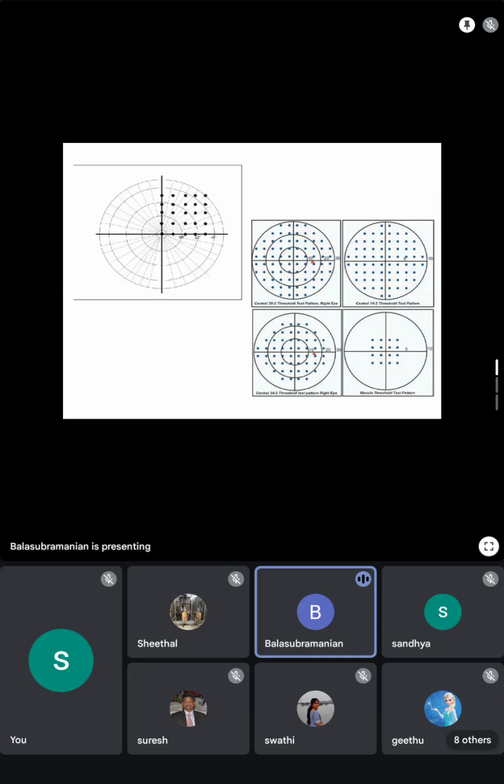If a person is not doing the test properly on one day, don't repeat it on the same day. Better give them a break. You can complete all the other tests on the first day, and set the repeat test on another day, which is comfortable for the patient and us. All we need is a good test result. Both of us have to devote time and concentrate. We have to ensure that the patient has a good test by comforting them and explaining the test.